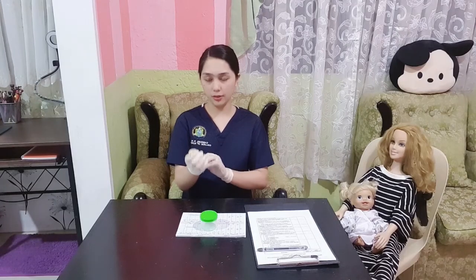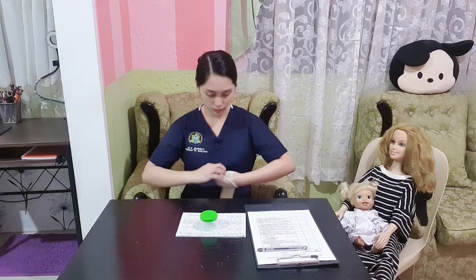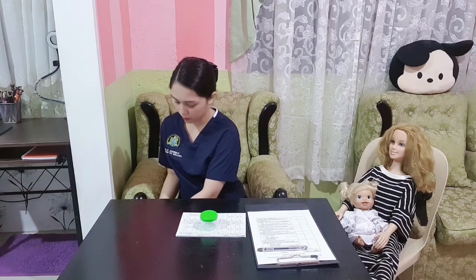Then I will now discard again the gloves. Now I will fill out the requisition form and send it to the laboratory with the specimen as soon as possible. For best results, bring the sample within 30 minutes of collecting it.